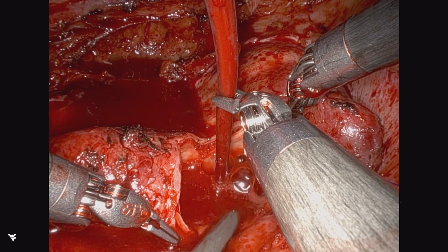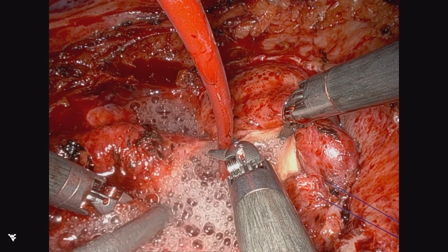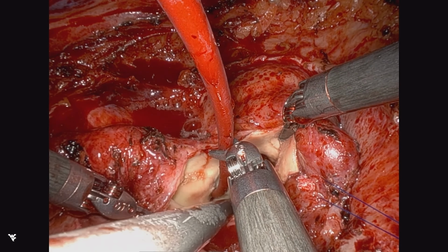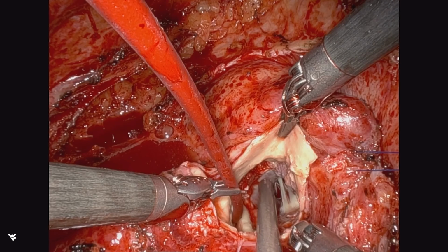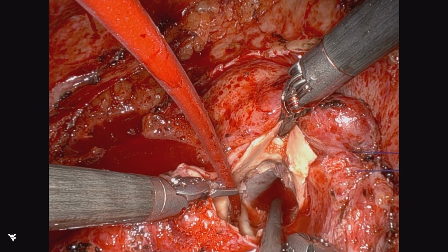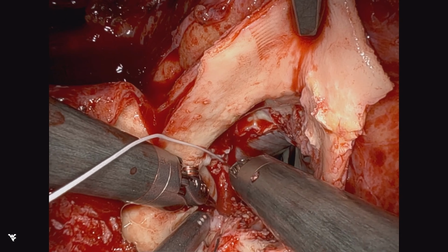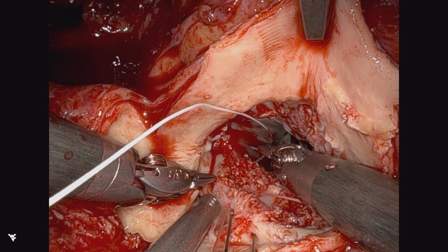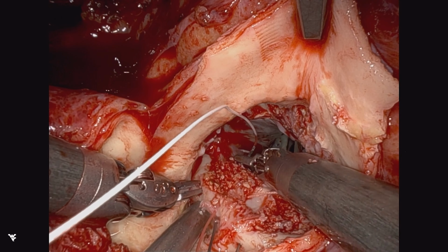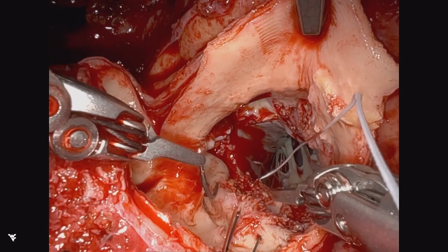So we intubate the left main ostia and irrigate both in the ventricle and the aorta because of any calcium that may have flung off during the debridement. So now we have a fairly decent, not total because of the penetration aspect, debridement of all that calcium. And this is going to be smooth and this will be fine.